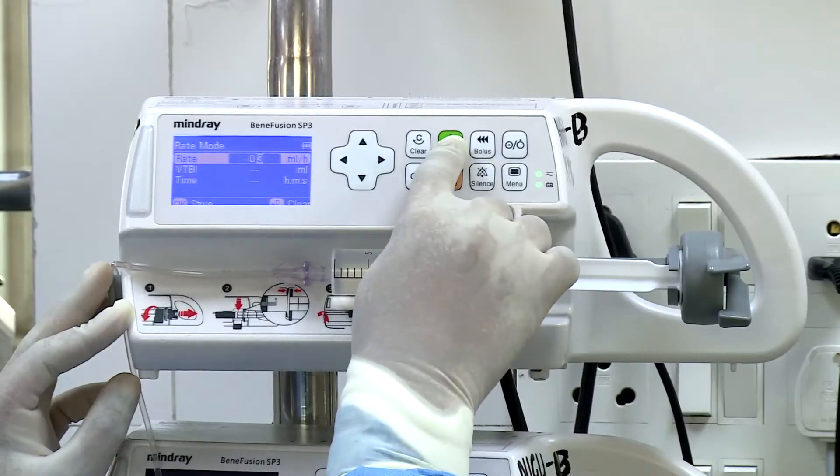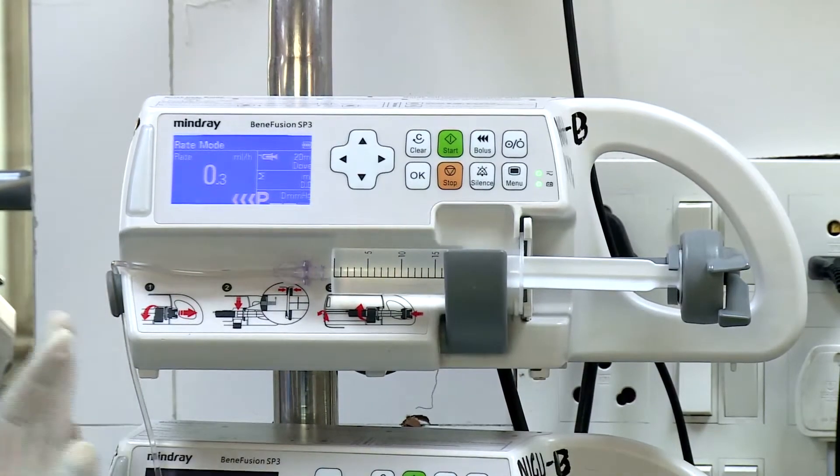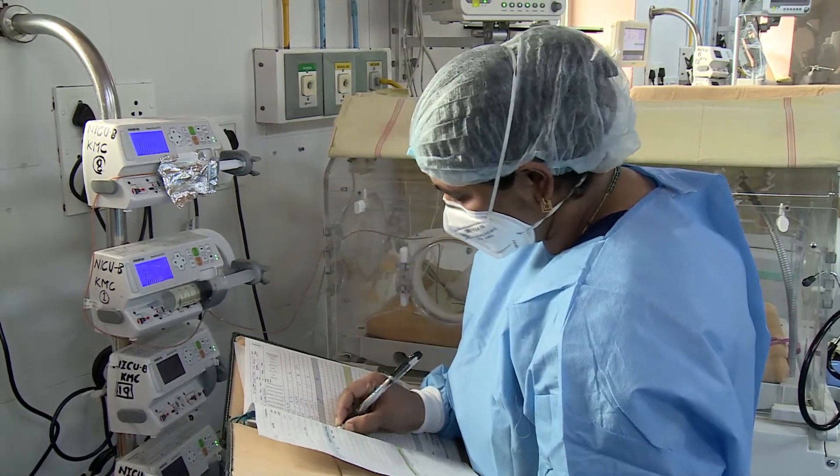Press the start button on the infusion pump. Record the details of the drug administration.